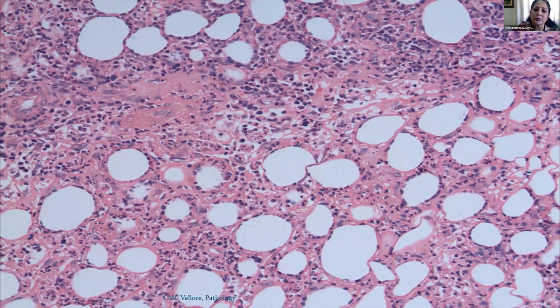What sort of infiltrate are you seeing here? What sort of necrosis are you seeing? What is this? What necrosis is this? Lipophagic, hyalinizing, liquefactive, basophilic. What do you think? I've got one answer which says hyalinizing. Very good. So this is hyalinizing fat necrosis. What is the infiltrate like? Lymphocytes, histiocytes, eosinophils, neutrophils. What do you think?